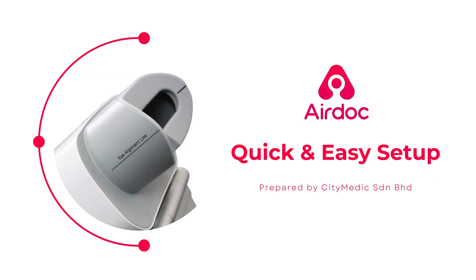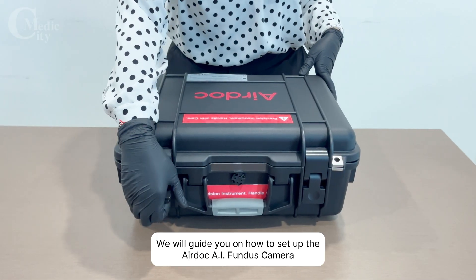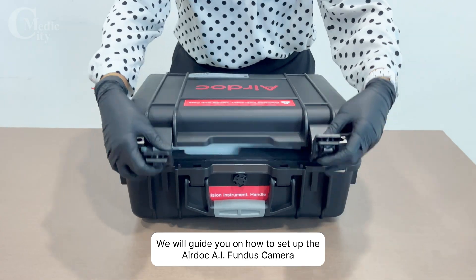Welcome to the AirDoc setup video. In this video, we will guide you on how to set up the AirDoc AI Fundus Camera.